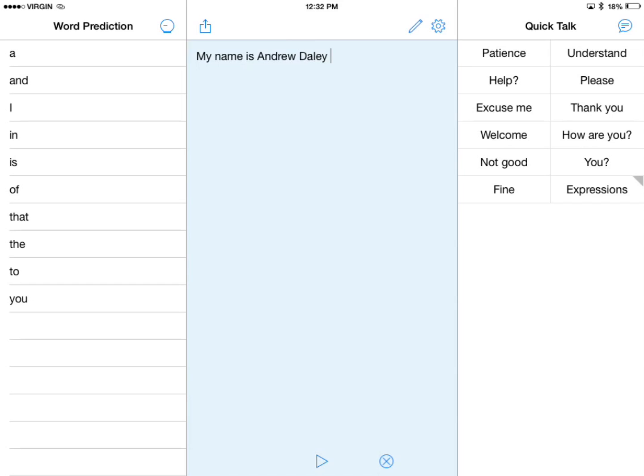And it's primarily used by folks who have disabilities such as autism to verbalize what it is that they want to say. Another famous person who uses AAC would be Stephen Hawking, and he has Lou Gehrig's disease. So there are quite a wide variety of folks who benefit from the use of this type of software.